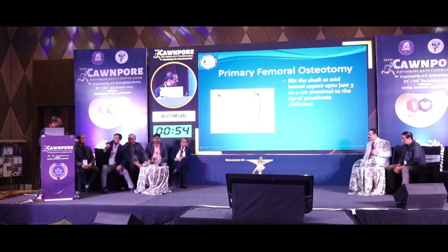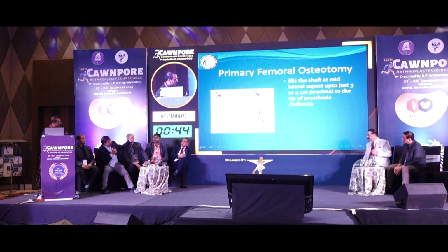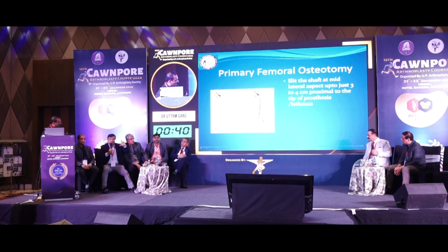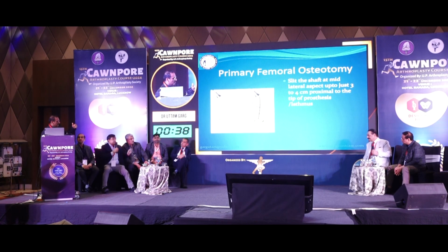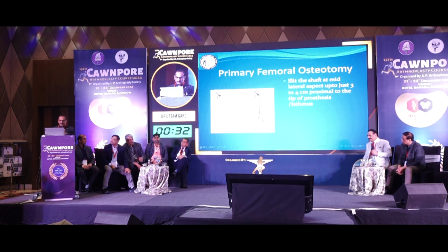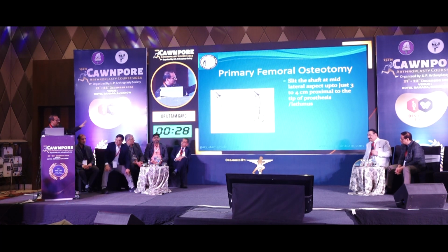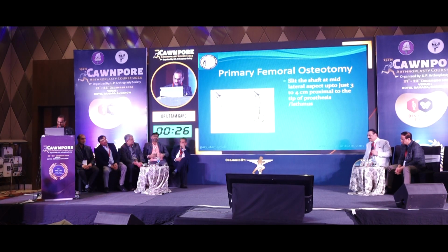You are not happy with this? This will work very well if your stem is not broken, so that you can put in the slap hammer and take it out. You just want to decompress the cortex, right? True. But with your broken stem and the top part out, I don't know how you will reach that bit of bone which is lying below using this technique. You can use the Wise plier and catch it in the mouth. It is possible, but of course, if it is a full stem, it's easy. But in this scenario, in the broken state, it's not possible.